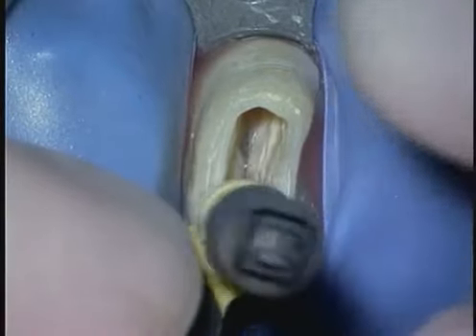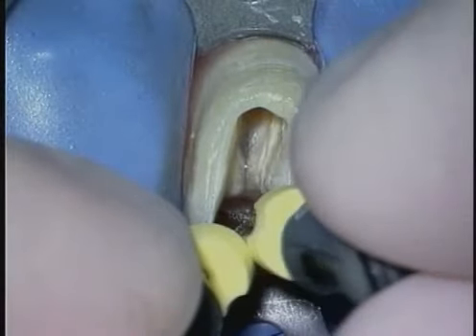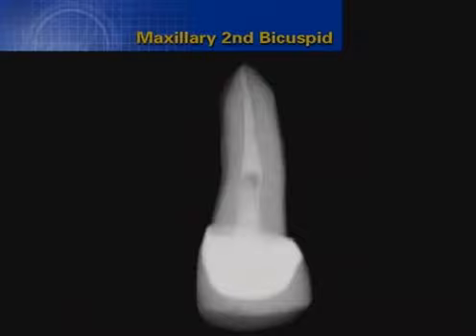It's convenient to insert both instruments, so that when a film is taken, you get information regarding both canals. The post-op film demonstrates the endodontic procedure, conservative shapes in the MB, DB, and palatal systems, and that the bridge has been re-cemented into place. Maxillary second bicuspids can have broad roots and commonly hold 2 canals. You can see in the mesial angle there's asymmetry between the gutta percha and the lateral walls of the tooth.